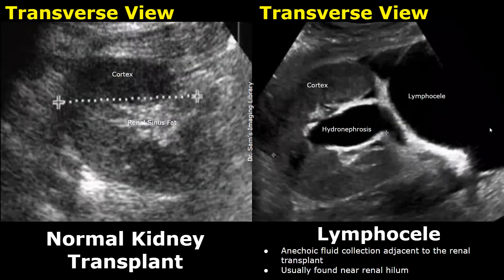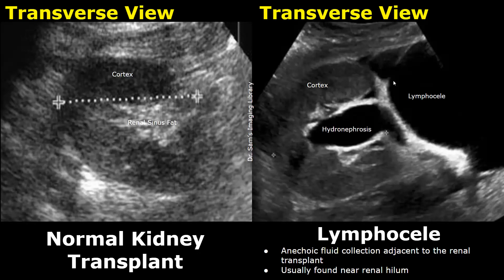A lymphocele is the most common type of fluid collection seen after a renal transplant. It may occur a couple of weeks after the operation. A lymphocele usually appears as an anechoic fluid collection adjacent to the renal transplant, and it is usually found near the renal hilum. Small lymphoceles can be ignored, but large lymphoceles may compress the renal vasculature, which can be concerning.